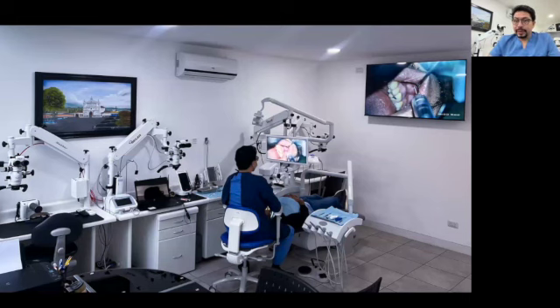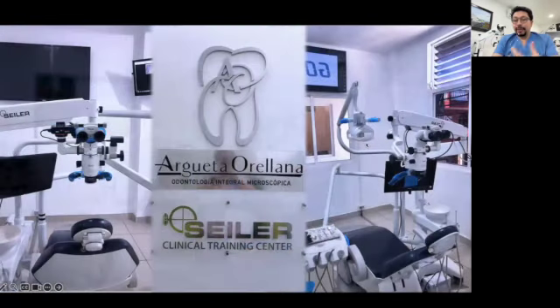It was our objective, my wife's objective, and my objective, because my wife is in charge of the prosthetic procedures here in the office. You can see the setup in one of our operative rooms. And nowadays, we already achieved our objective, and every dental chair has a microscope. We do everything under the help of magnification of the microscope. We have 3D microscopes, and we have regular microscopes as well.